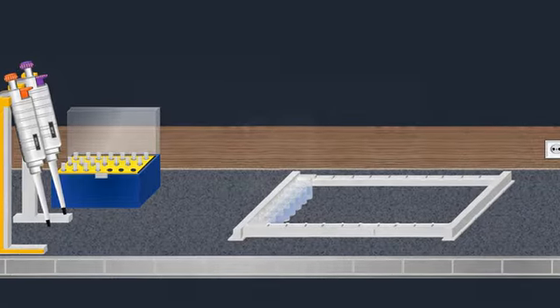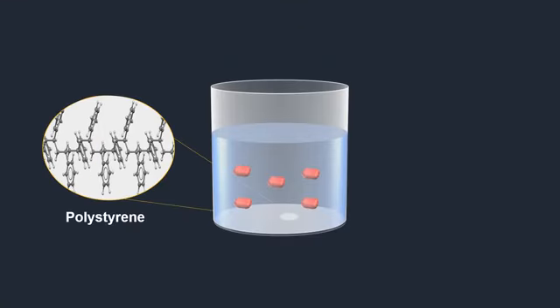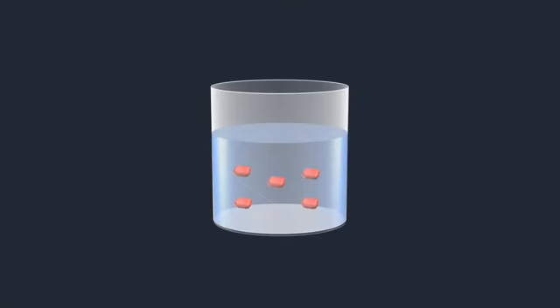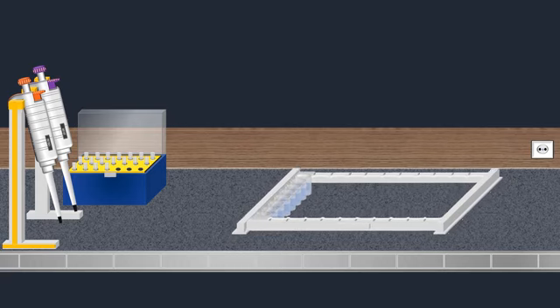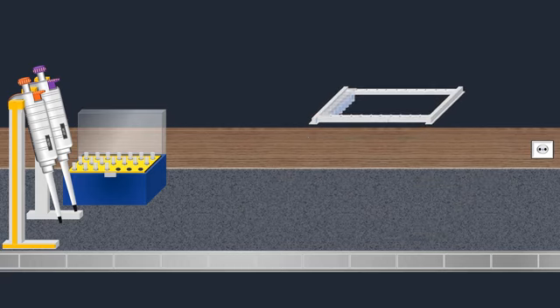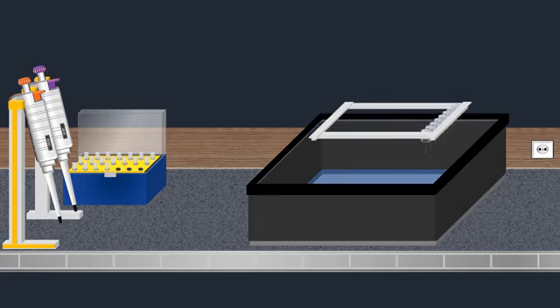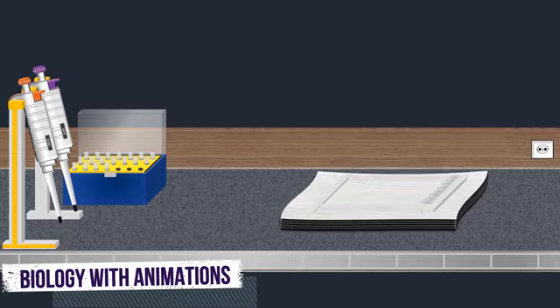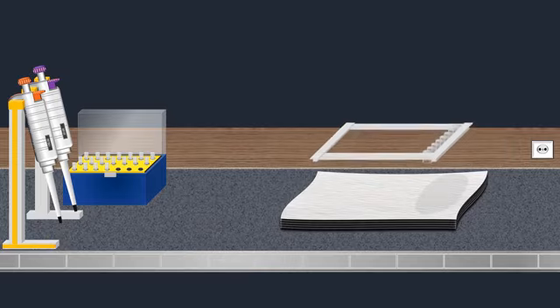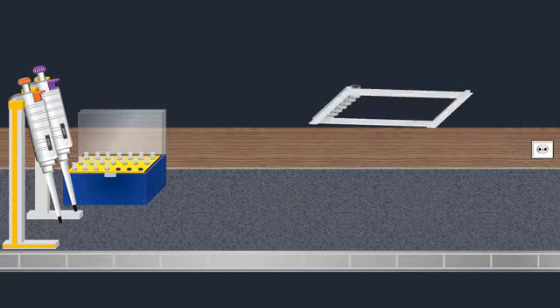In ELISA, the most commonly used material, as the solid phase, is polystyrene. The antigen is immobilized onto the polystyrene surface. Next, the adhesive plastic is removed. Then the well strip is overturned and tapped to remove the excess antigen solution. Also, an absorbent paper towel is used to ensure the thorough removal of the antigen solution.